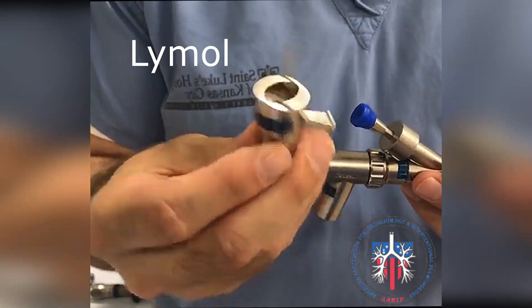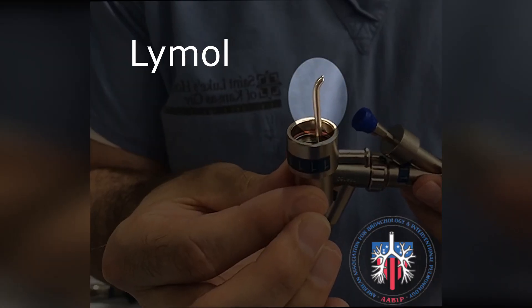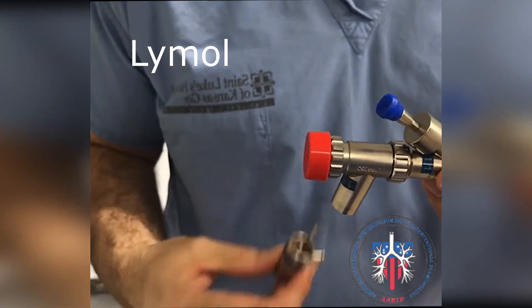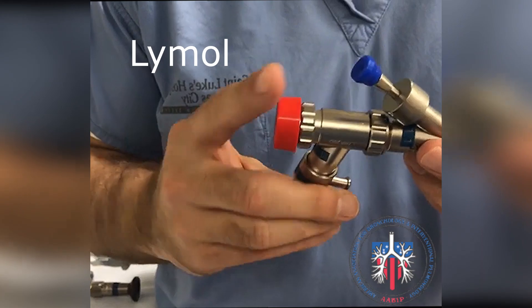Here is a Lymol jet ventilator adapter. This tip should be oriented towards the distal end of the scope. This is where the jet regulator hose is connected. The adapter is connected to the rigid scope in this manner.